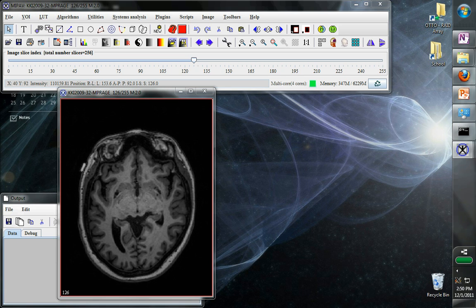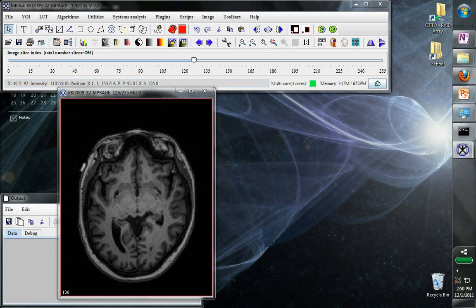So what we can do is use this scripting tool in MiPav to actually tell MiPav a sequence of steps that you want to apply and then give it a few images to apply those steps to. So the first step here is to actually record a script and tell MiPav what we want to do.